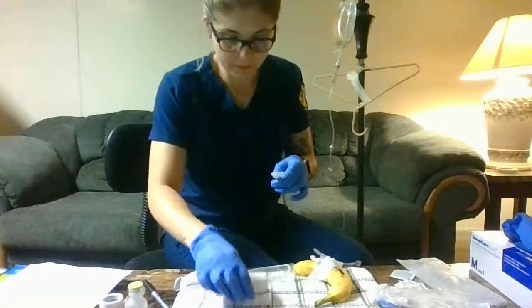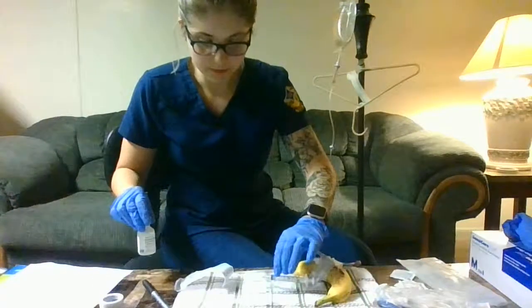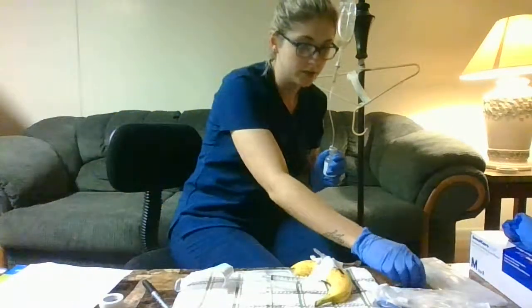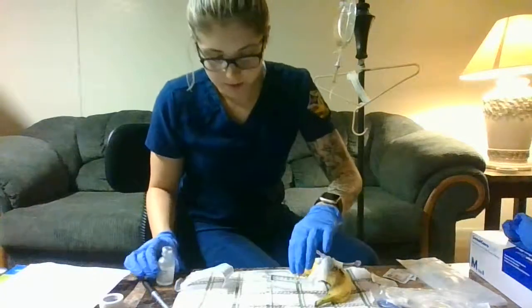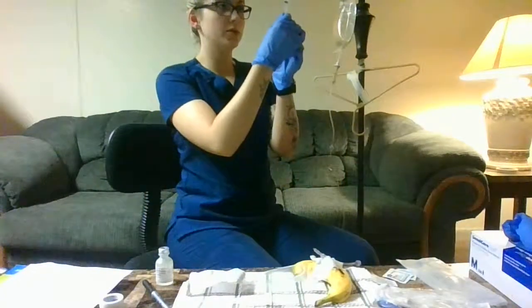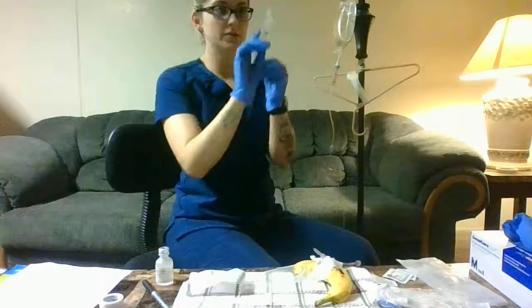Okay. Pull that out. Set that down. The inside is still clean. We are going to clean the top of this with an alcohol swab. We are going to pull out the 1.1 milliliters of air.